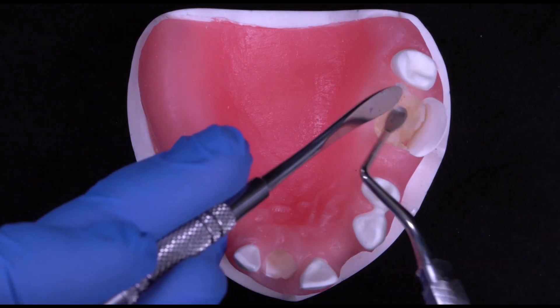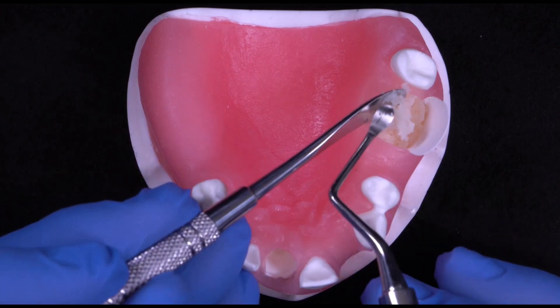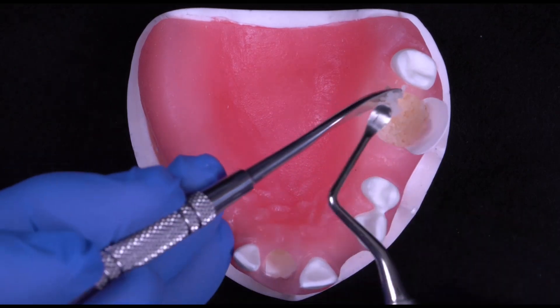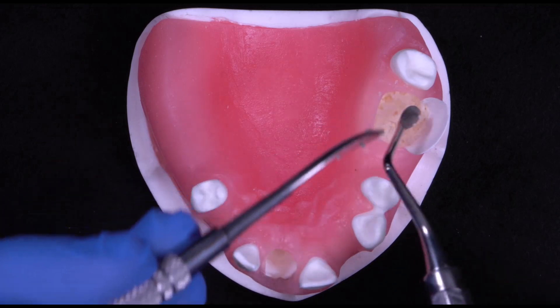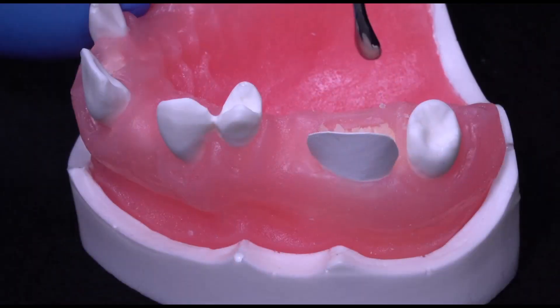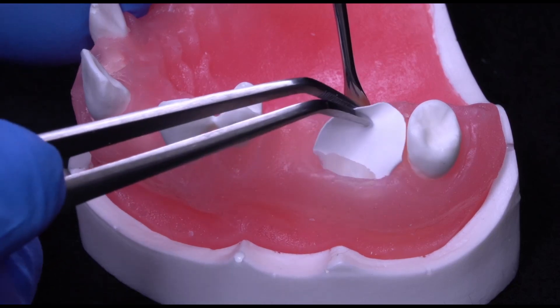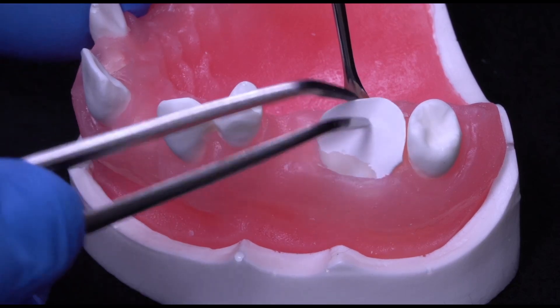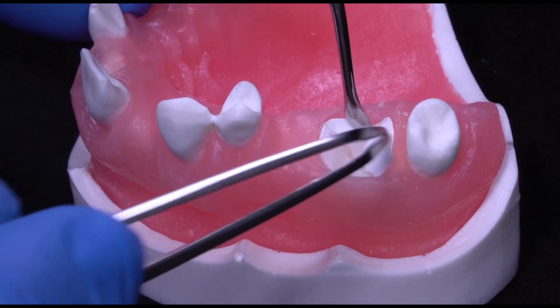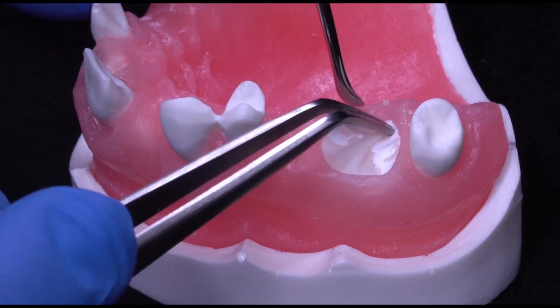The bone is gently placed into the socket site in small increments to ensure graft material is placed into all areas of the socket. Care should be taken not to over-condense the bone. Once the bone fills the extraction site, the collagen membrane can be tucked between the palatal soft tissue and the bone.